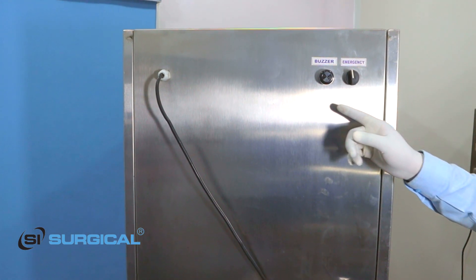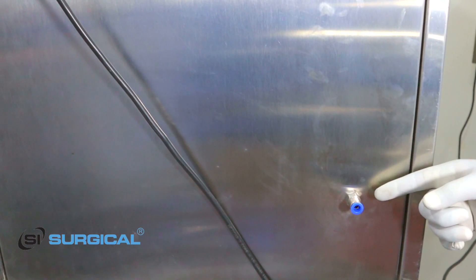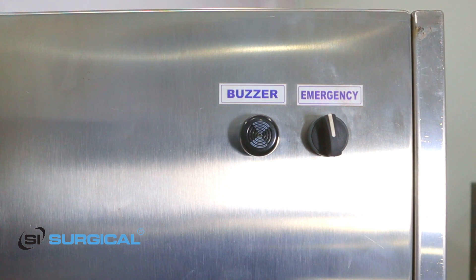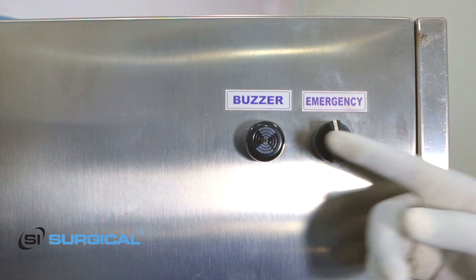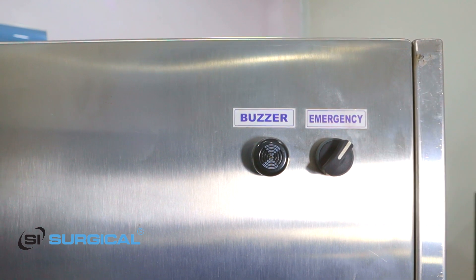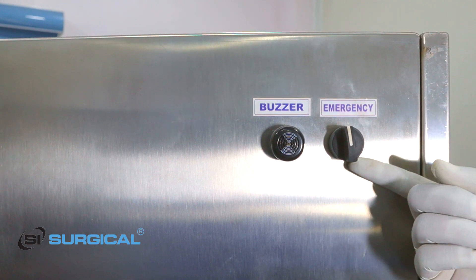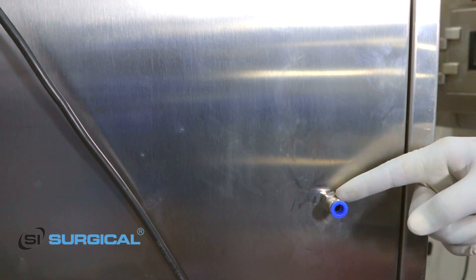This is our buzzer for emergency. This is our emergency on/off button. This is our EO outlet line. In case of any emergency situation or any fault during running condition of the EO machine, the buzzer will go on and the EO outlet system will automatically activate. For manually activating our emergency outlet system, we have to turn on this switch, which will automatically drain the EO gas from the chamber through this exhaust valve.